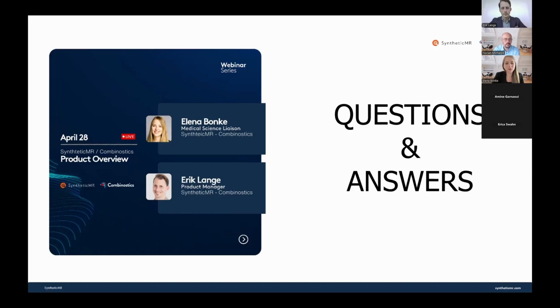And maybe one thing I can also mention here is not only the time on the diagnostic side gets reduced, but also the time on the reporting side, because one of our most recent additions that I haven't mentioned before is that we now for SyMRI also have a structured report that we can produce. So you get all the information from the PDF reports also in a structured format, and you can then implement this in your hospital IT system, for example, with PowerScribe or Epic, so that you get those values automatically transferred into your medical report.